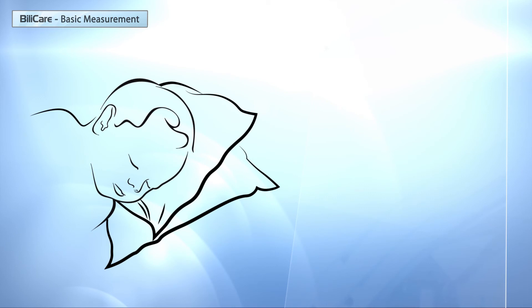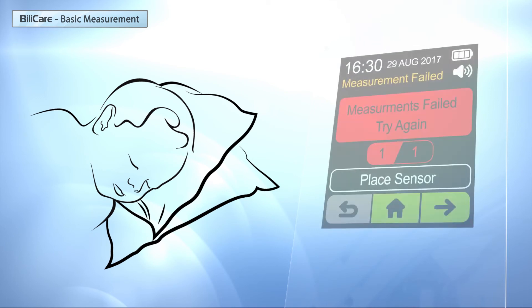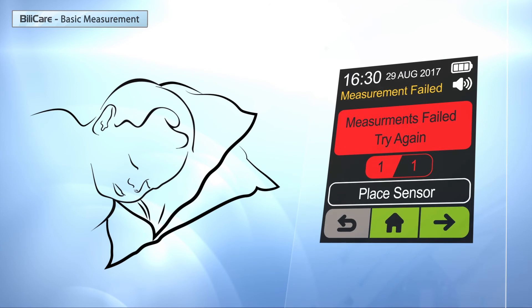Baby movements may alter the results. In some cases, BILICARE may encounter a measurement error. When this occurs, a measurement error screen will appear. Address the error described on the screen and try again.